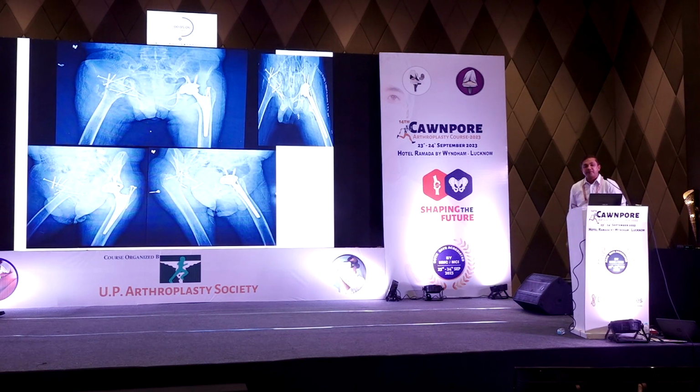Then what we did, we did a total hip on the left side, which was normal. The two screws for the GT are for the trochanteric osteotomy? No, sir. The bone was very osteoporotic. He was bedridden for 7 years and had cachexia also. So while reducing it, I found there was a small split. That's why we have put 2 screws.